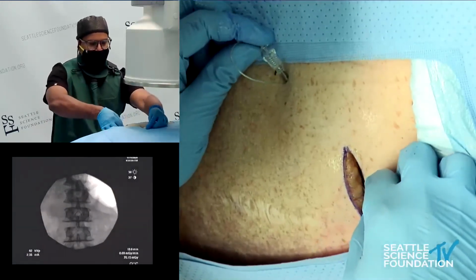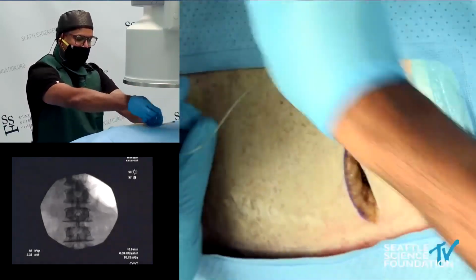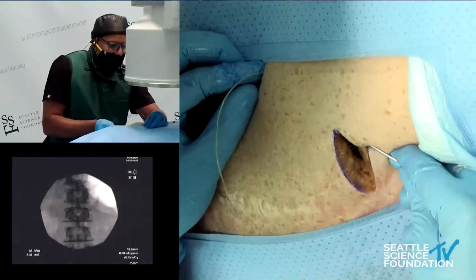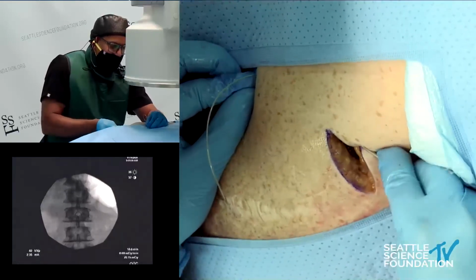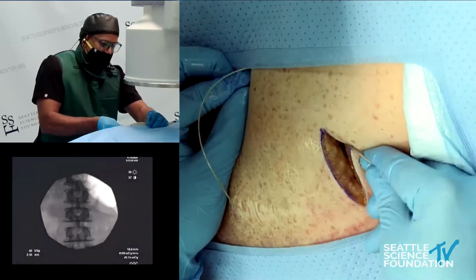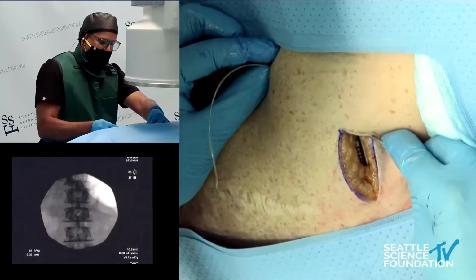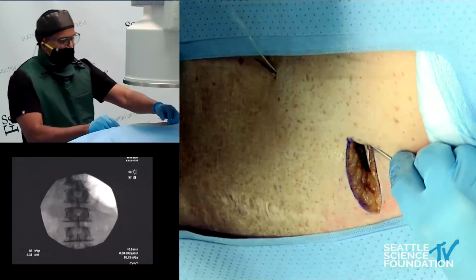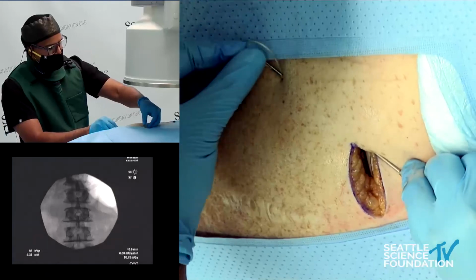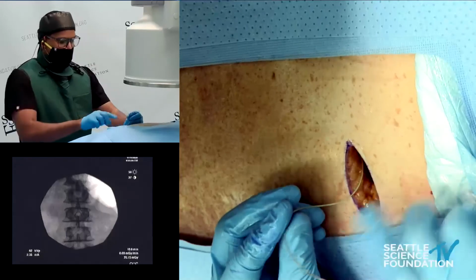Again, you'll have a tunneling tool, and I guess I should have reversed it because I'm trying to be MacGyver here and not have to use that tunneling tool. But because that hub is in the way, I can't do that, so I'm going to come around the other side and make sure I don't damage my lead. And so I'm putting pressure on the lead right now. There we go. And now we'll get that through the bevel. And once you get all that through, perfect, pull that out, comes through, and then connect your IPG.